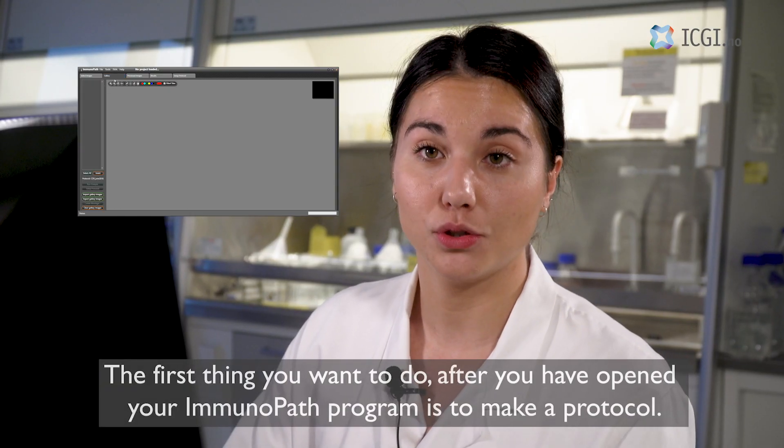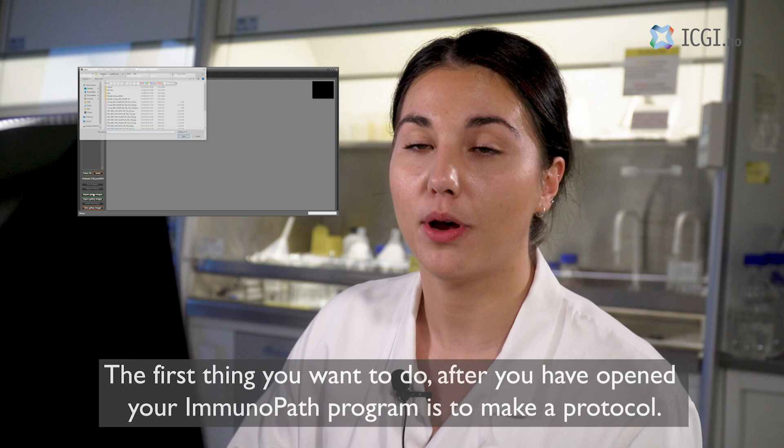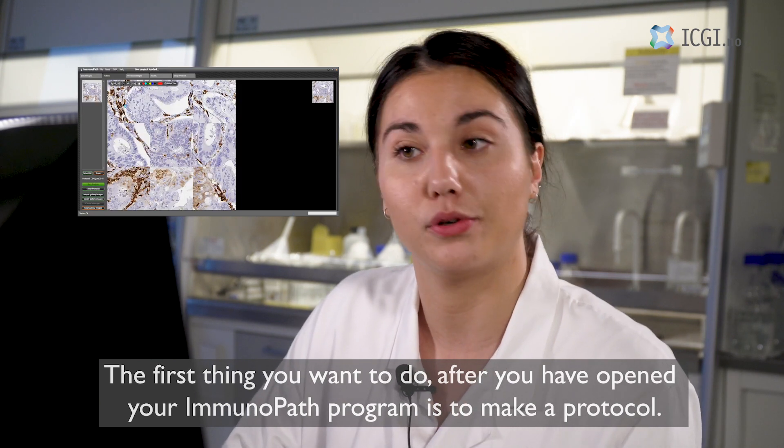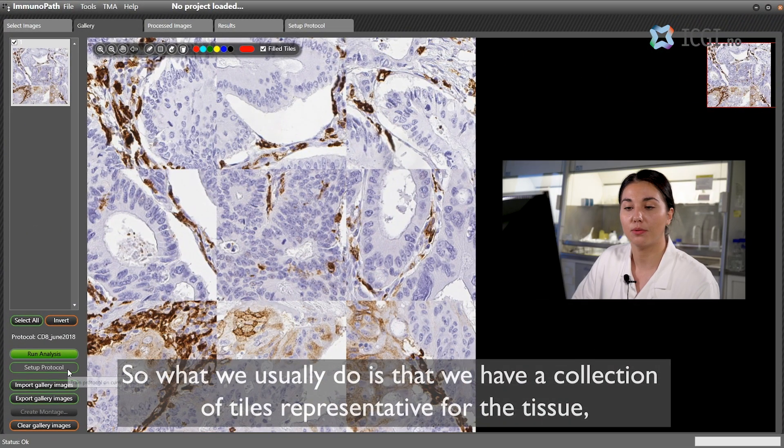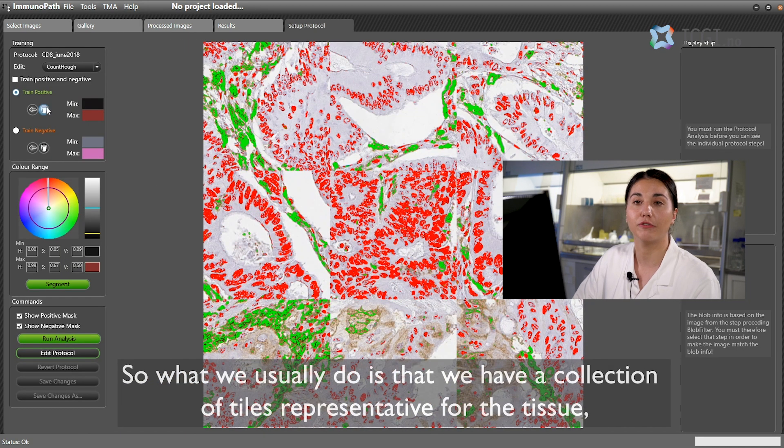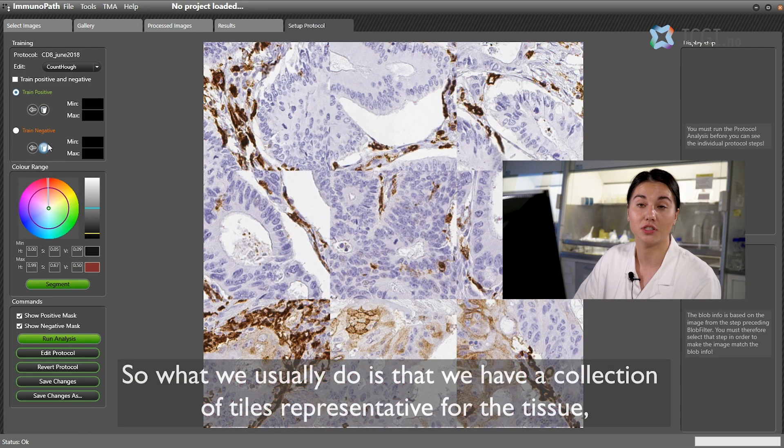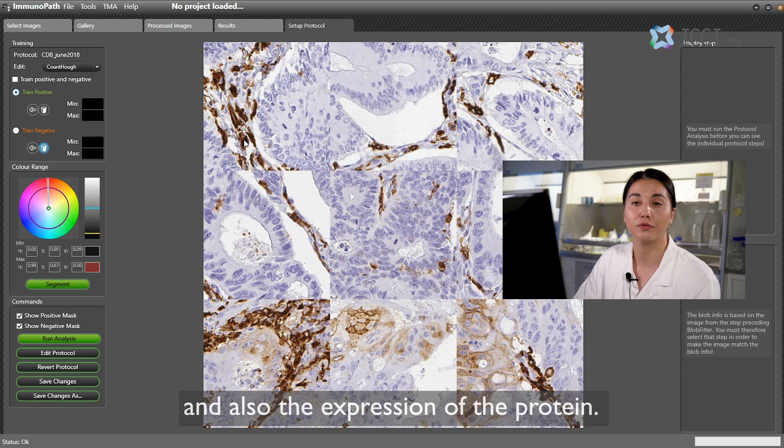The first thing you want to do after you have opened your ImmunoPath program is to make a protocol. So what we usually do is that we have a collection of tiles representative for the tissue and also the expression of the protein.